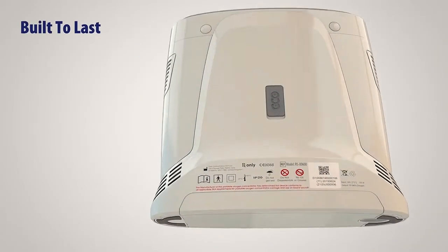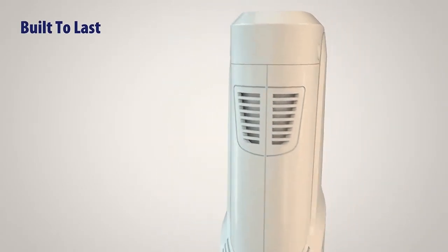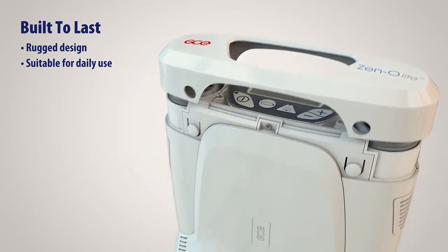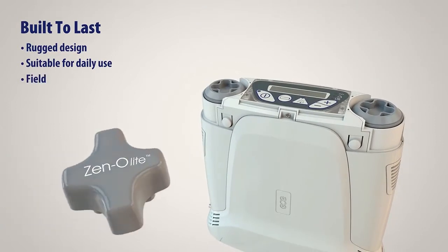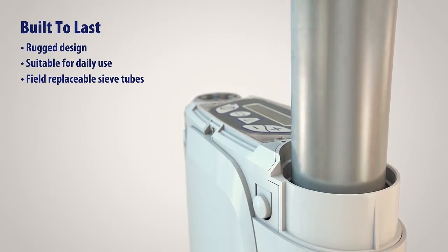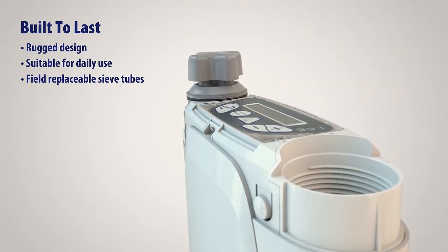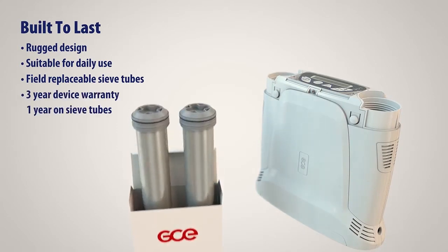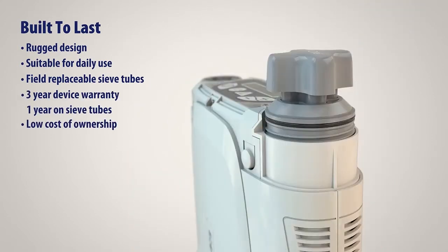XenoLite is built to last. Its compact and rugged design makes it suitable for daily use. The sieve tubes have a one-year warranty and can be replaced easily using a custom-made tool. The device is supplied with a three-year device warranty and offers a low ongoing cost of ownership.